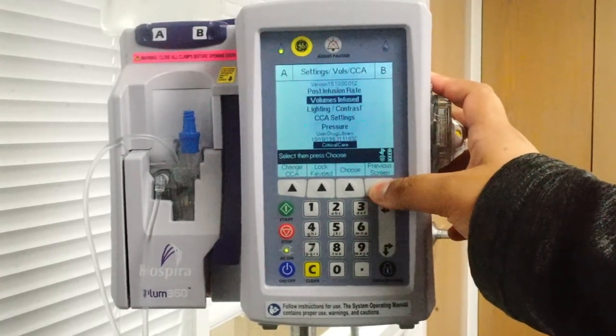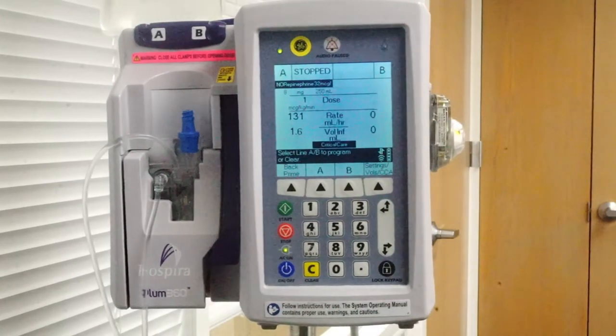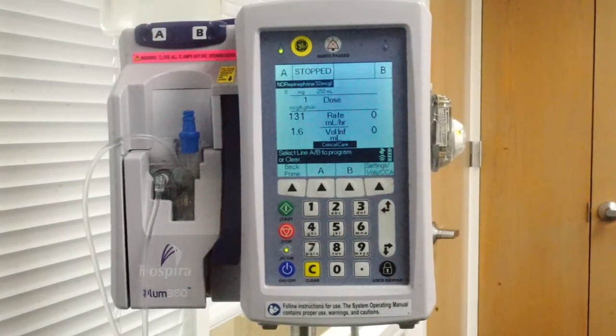The other thing about zeroing your pumps is that people forget or they get caught up on things. So if you come in, say they were supposed to zero the pumps at 6 and now it's 7 and we haven't zeroed the pumps, zero it then. It's still going to save you some time doing all those calculations for I's and O's, and it's also going to be more accurate. Same thing if you're zeroing the pumps and it's 1:30 and it's close to time, then go ahead and zero them. You don't have to come back in and zero them again because that volume can then be accounted for the next time.